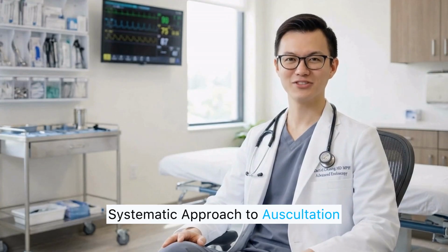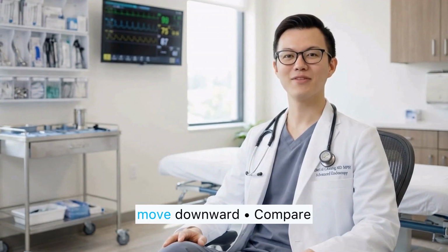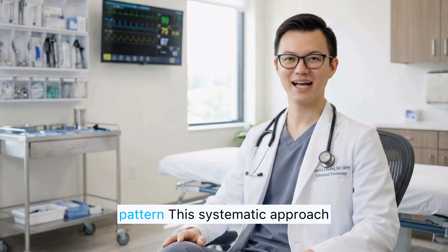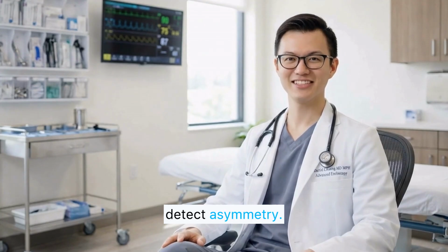Systematic approach to auscultation. Always start at the top, the apex, and move downward. Compare side to side at each level. Use a consistent pattern. This systematic approach improves accuracy and helps detect asymmetry.